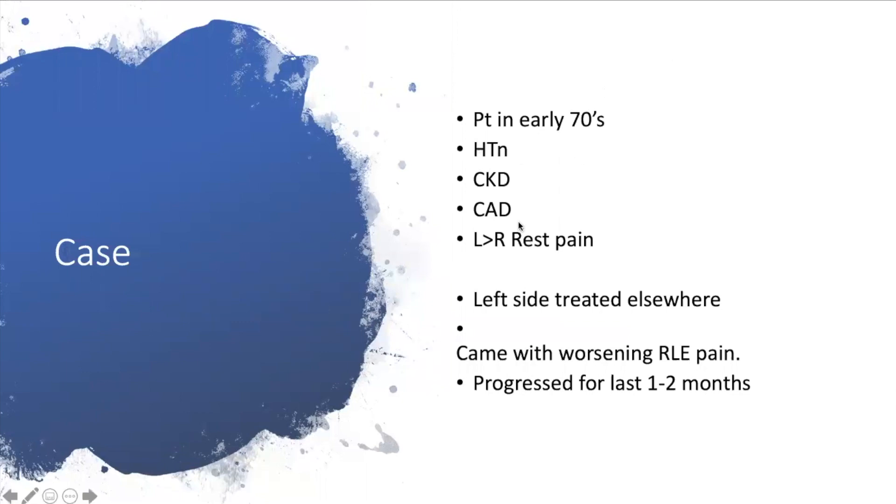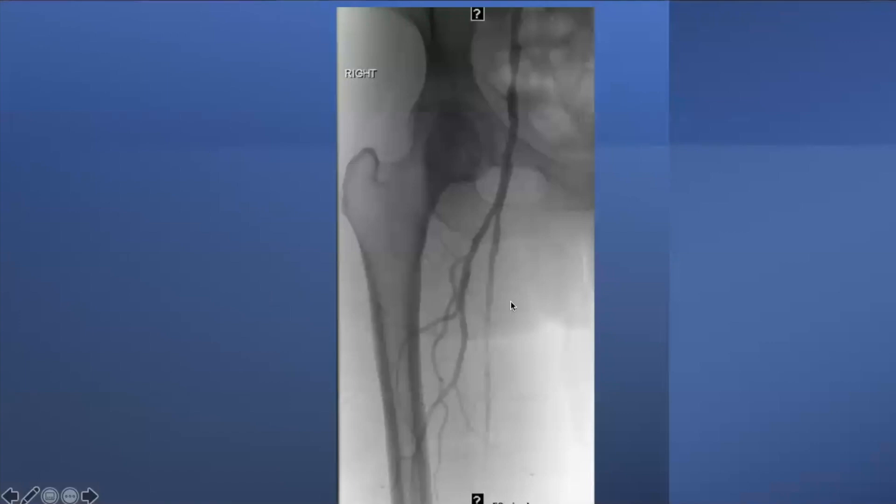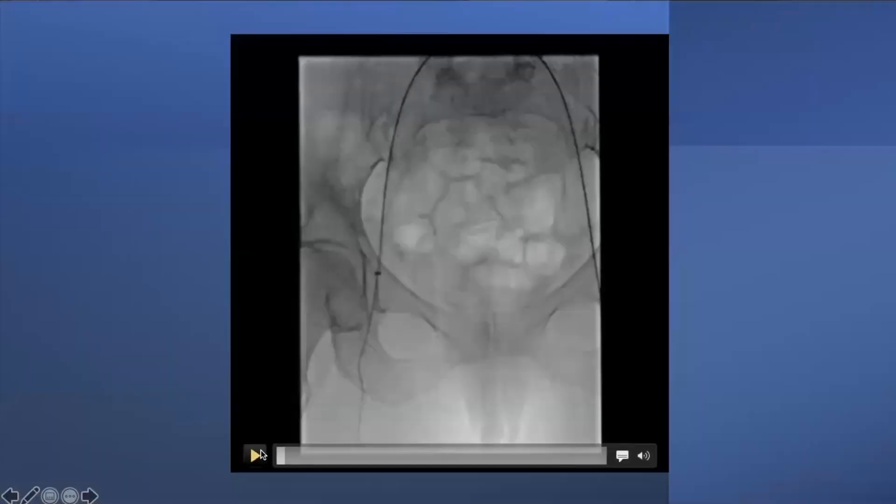A patient in their early 70s with the usual comorbidities — bilateral rest pain, treated elsewhere on the left side, presenting now with right-sided pain for one to two months. The initial angiogram shows some external iliac disease which we fixed, then diffuse SFA disease coming down into a segment that reconstitutes into the popliteal. An important point: the wire test. Using a 0.035 catheter and Amplatz wire, the wire just goes right through the lesion easily — which gets you excited.